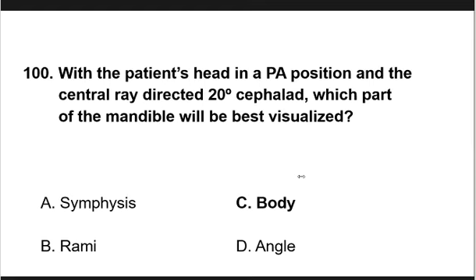Yung rotation po ba ng tube below 10 degrees, tangential po ba tawag doon, sir? Hindi. Okay, ganito. Ang pinag-iba natin doon sa tangential at axial, pag axial, tubo ang naka-angle ng 10 degrees or more. Ibig sabihin, kung ang angulation ay 5 or 7 degrees, hindi tayo gagamit ng axial na word. So gagamit lang tayo ng axial na word kung ang angulation ay 10 degrees or more.